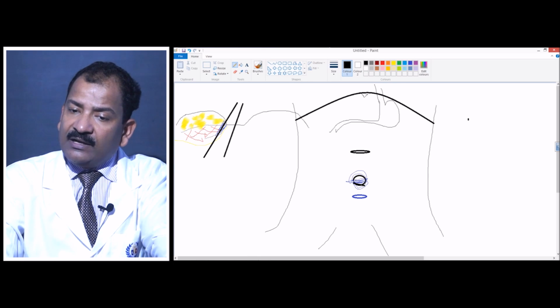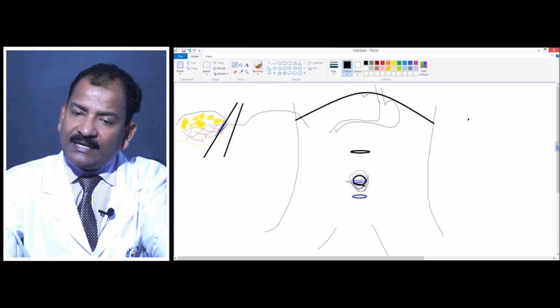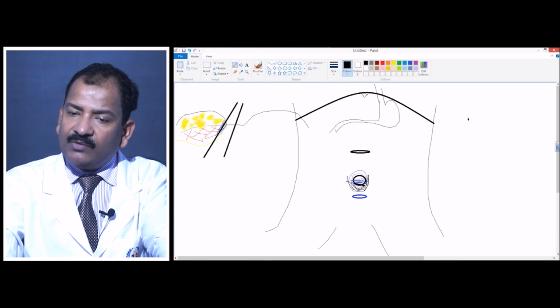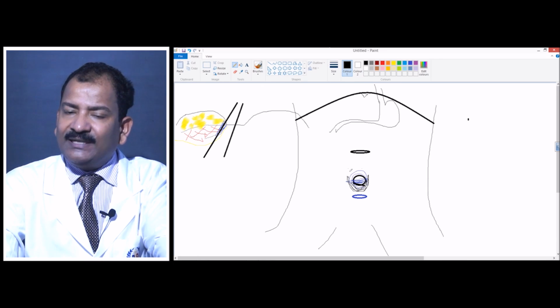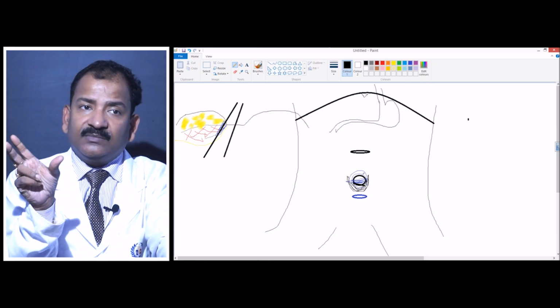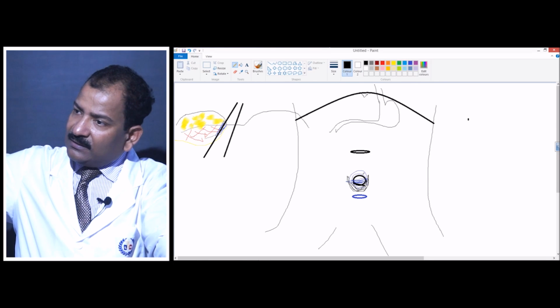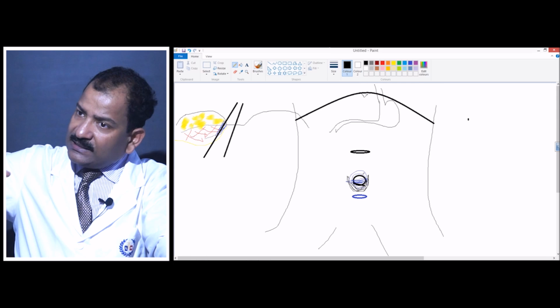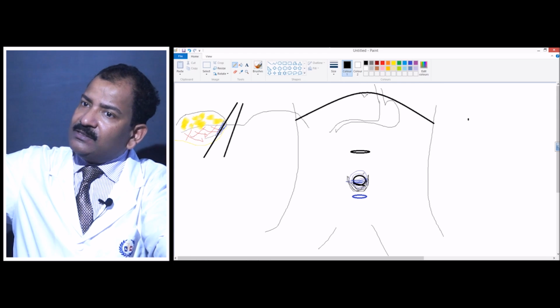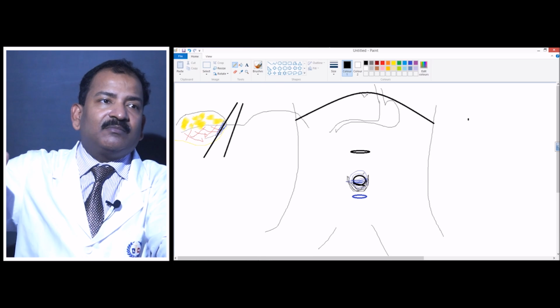Another important advantage of the smiling incision is that if you have to enlarge the incision, like in single incision surgery, the diameter of the incision may be only 10 millimeter but actually it is 20 millimeter. If you make it circular like that and enlarge it, it is actually 20 mm, but as soon as your work is over and your trocar is out, it again becomes 10 mm.